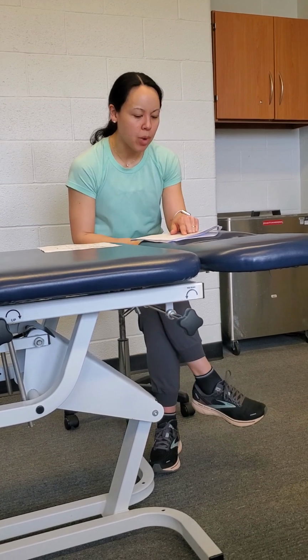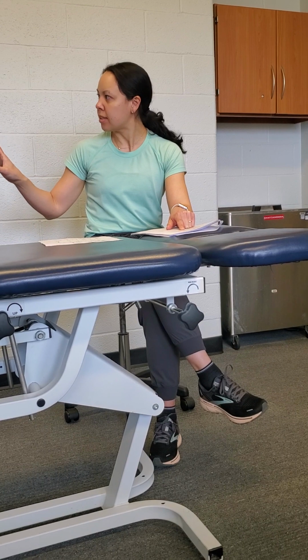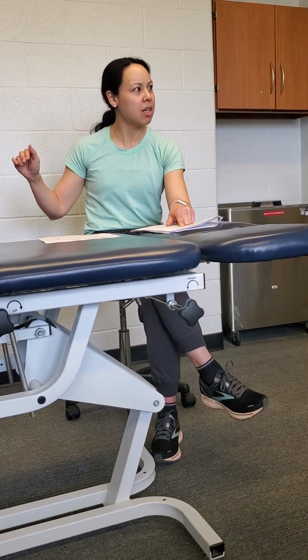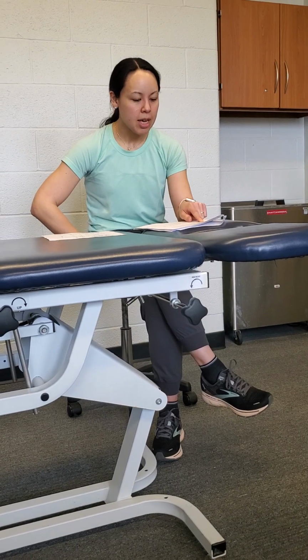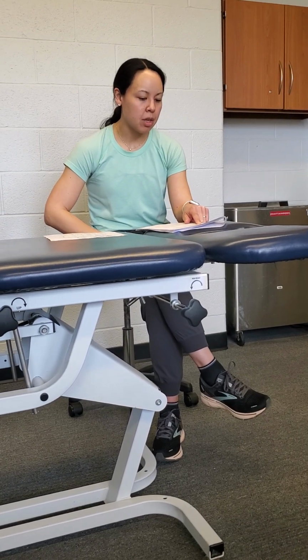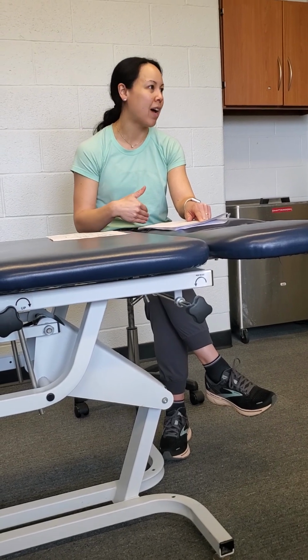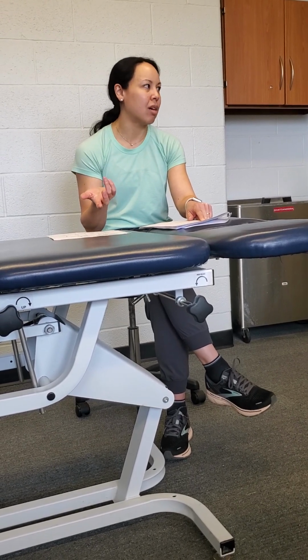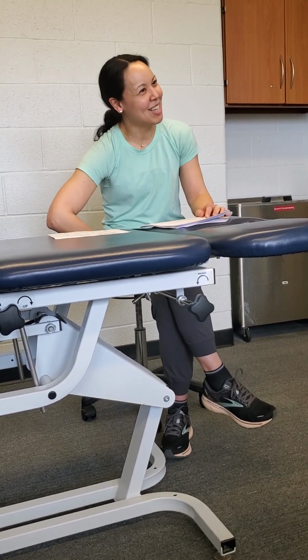Typical treatment time for one exercise is about 6 minutes. I think this is preset for 6 to 8 minutes for each exercise, so it makes it really user friendly. And typically the number of exercises you're going to do in a typical session shouldn't exceed 5. With our 30-minute treatment sessions, I don't think we would be able to do more than that anyway, so that's fine. Not something to worry about.